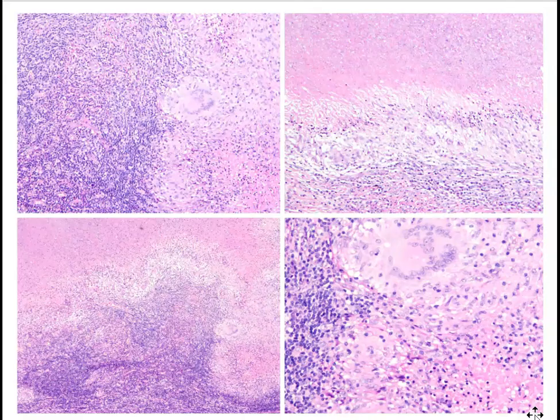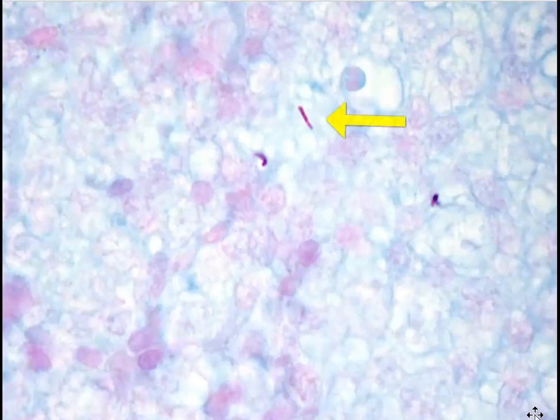There is central caseation-type necrosis surrounded by aggregates of histiocytes and Langhans giant cells, chronic inflammatory cells including lymphocytes and plasma cells. Acid-fast bacilli may be few and scanty. They are not essential for diagnosis, and even when absent, clinicians should be advised that tuberculosis is not excluded and is in fact rather likely in this region.